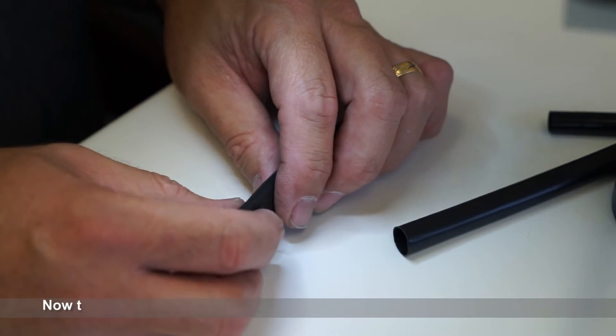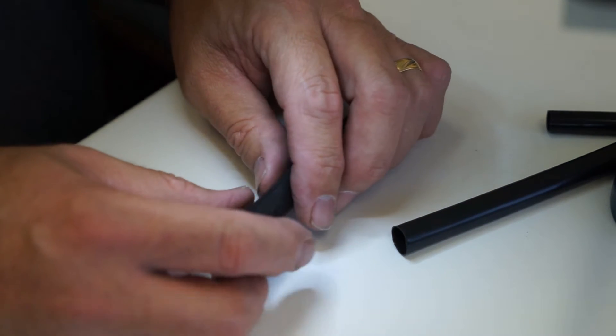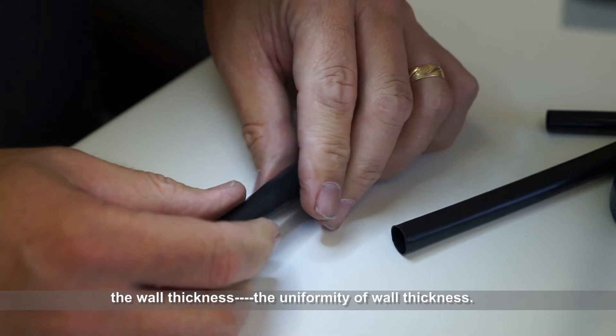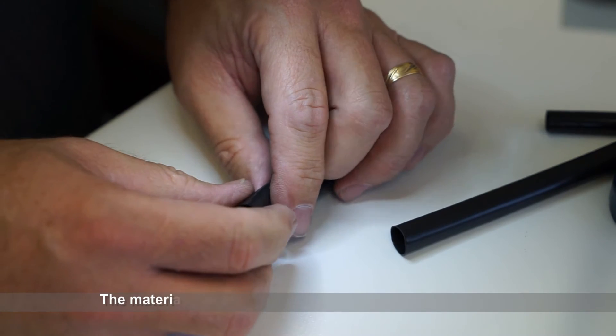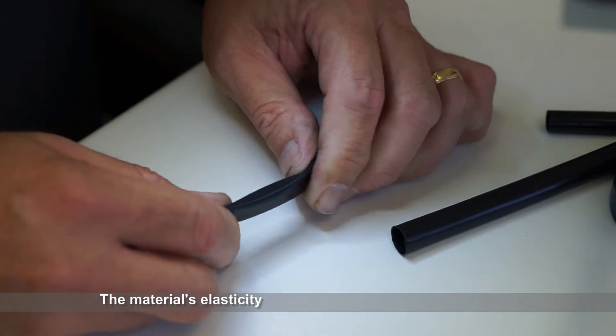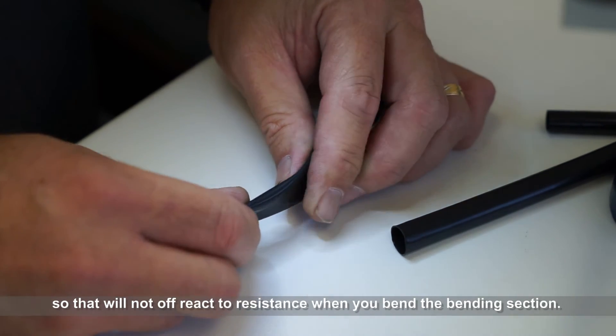Now the construction of the bending rubber needs to be considered. The wall thickness, the uniformity of the wall thickness, and the material's elasticity so that it will not offer extra resistance when you're bending the bending section.